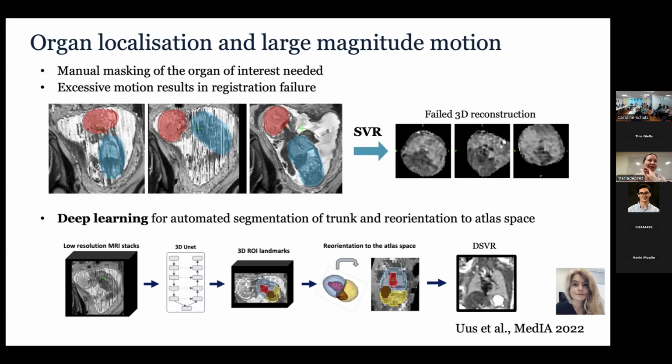So we figured that if you just take a stack of consecutive slices, in this kind of acquisition we have 4 passes of that. So we split it into 4 packages, and the package then looks similar to clinical data. Maybe it's even a bit thicker, but then we can rely on it being relatively stable in terms of motion because it's consecutively acquired, and we do it in 3D. And that seems to work.